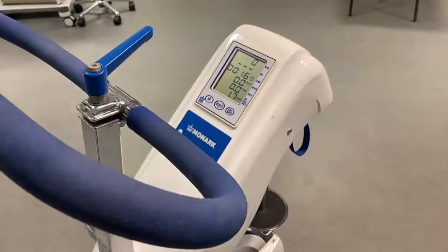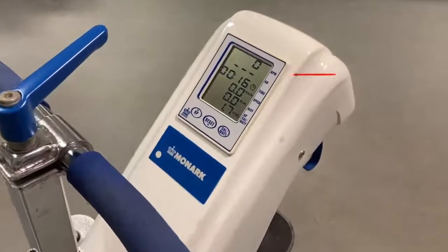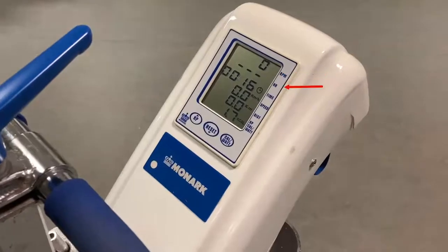As you can see here, the Monark can provide info on cadence, heart rate if wearing a polar chest strap, time which is triggered on the first pedal revolution, speed, distance, and calories burned. However, we commonly only use cadence and heart rate from the Monark screen.